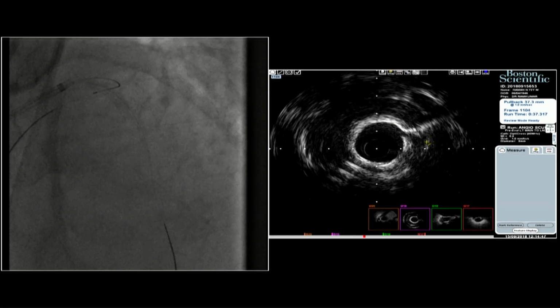Bring it to the ostium. It's a very short left main, sir. We made some measurements. The distance from the distal disease to the diagonal is 22 millimeters. From the diagonal to the ostium of the LAD is 44. Sorry, it's totally 44. So approximately we will require 2 stents, because we're going to use an Onyx, so we don't want to have difficulty in tracking.